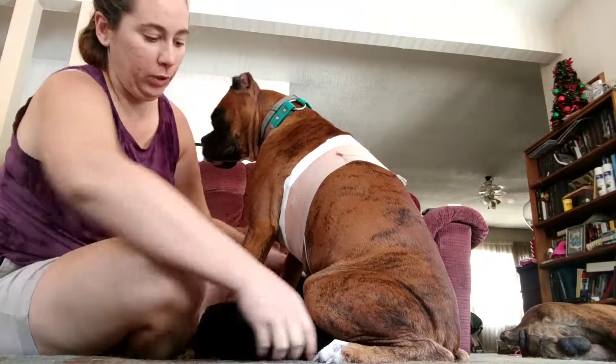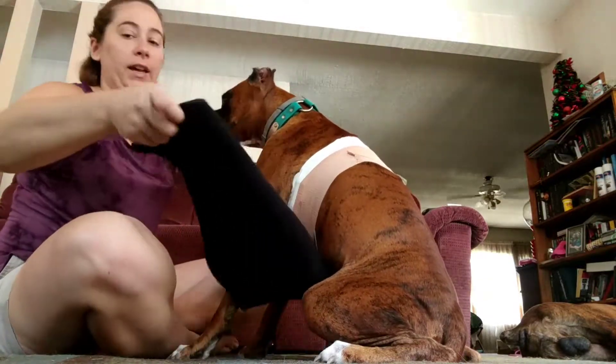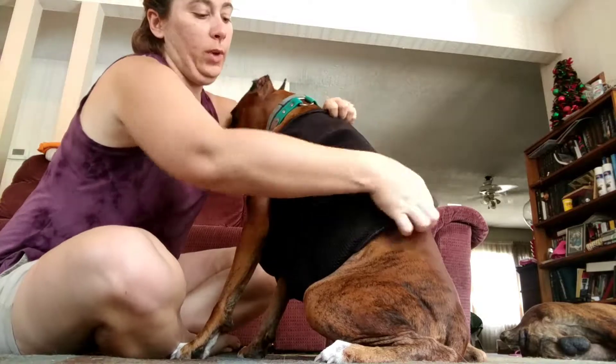Now you're going to take the vest and go ahead and tie it around the body.